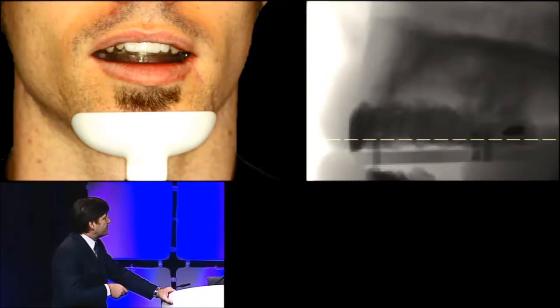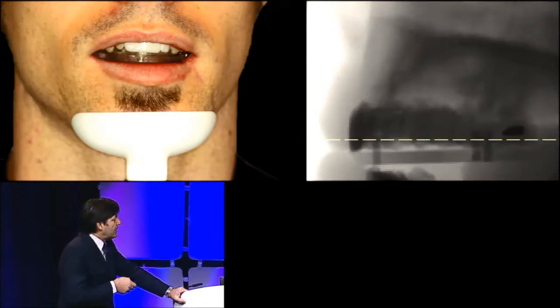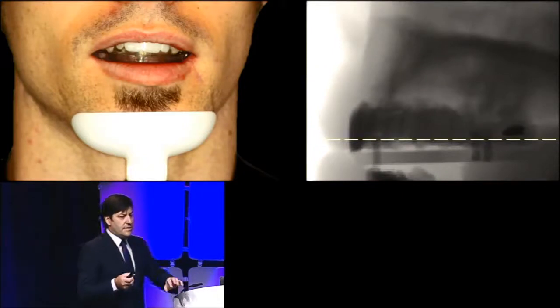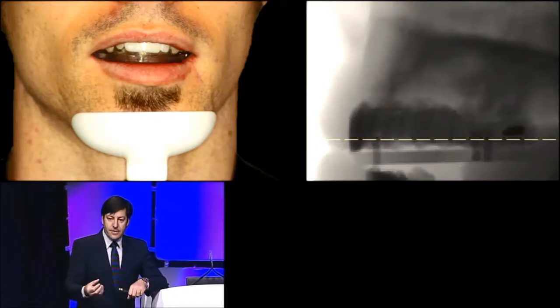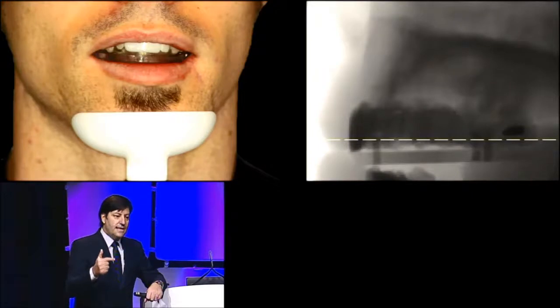And as you can see here, this patient is being exposed to the three-dimensional imaging with the reference of the future prosthesis in relation to the anatomy of that patient. And I say that particularly at the beginning because this is kind of a general perception: you see the patient, you are planning for implants, the immediate next step is to take a cone beam CT. And I don't think that that's the right workflow. Cone beam CT will come at the moment when you have done your prosthetic planning.